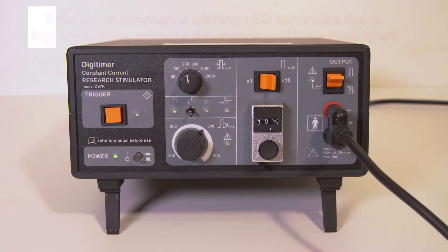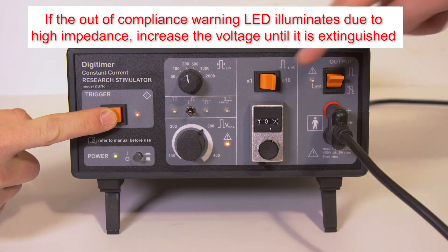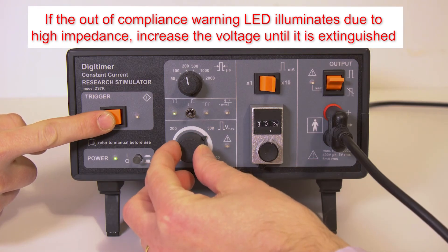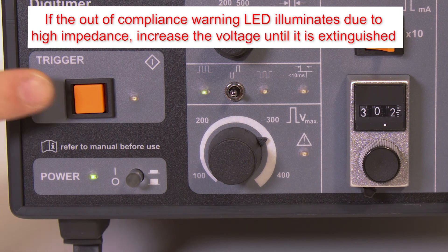When stimulating at higher currents or through high resistance electrodes, the amber out of compliance warning LED may illuminate, indicating that the requested current could not be delivered. Increasing the voltage should restore the current to the correct level and extinguish this LED.